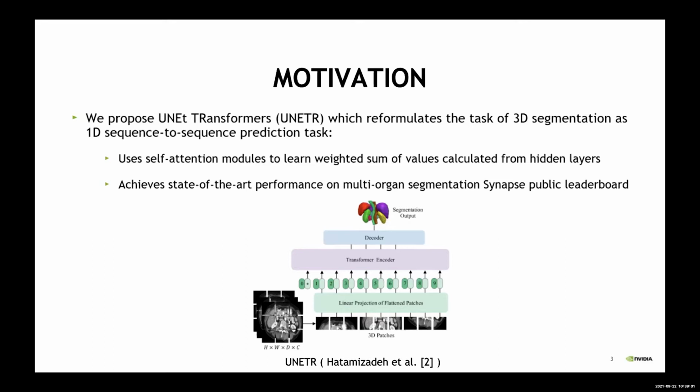Here I have a brief overview of our methodology, and I want to emphasize that our method directly utilizes 3D patches, which is important in the context of medical image segmentation. Our model achieves state-of-the-art performance on the multi-organ segmentation dataset. This dataset is known as Synapse, but the correct name is BTCV. Here I put the name Synapse so that people can relate to what they know about the Synapse dataset itself.